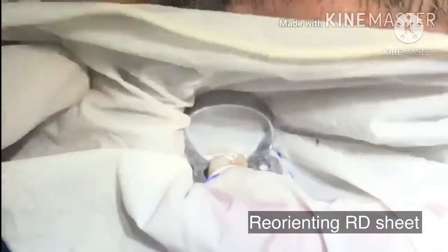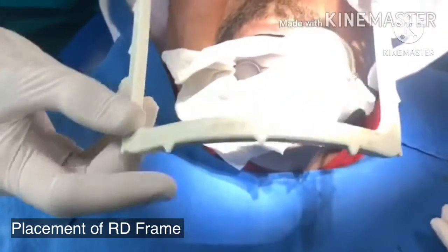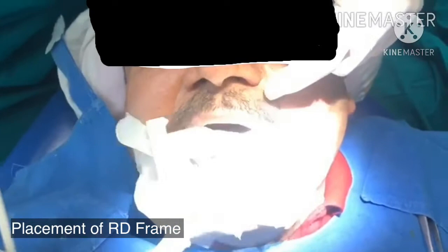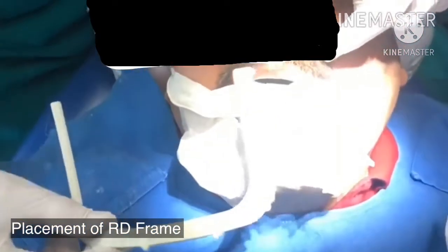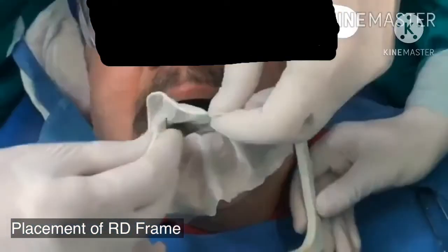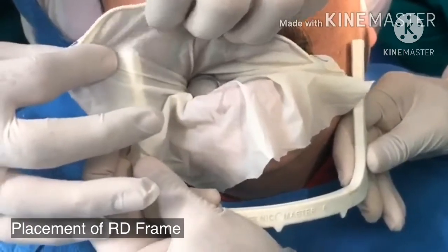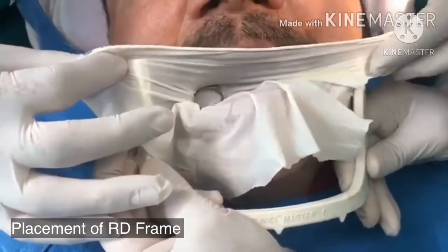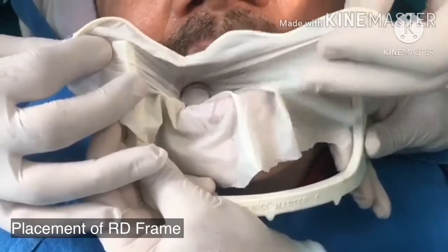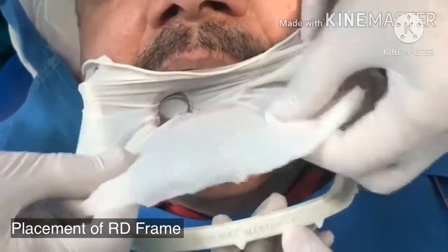Now after this, we have got the rubber dam frame. This is put below the rubber dam and parallel to the upper lip — it is very essential. Now after putting it parallel to the upper lip, we just estimate which part of the rubber dam comes in line with the upper, and we leave the rubber dam. Then we do a bilateral stretch on the right and the left side, hook and leave it. Similarly, now we do the lower.